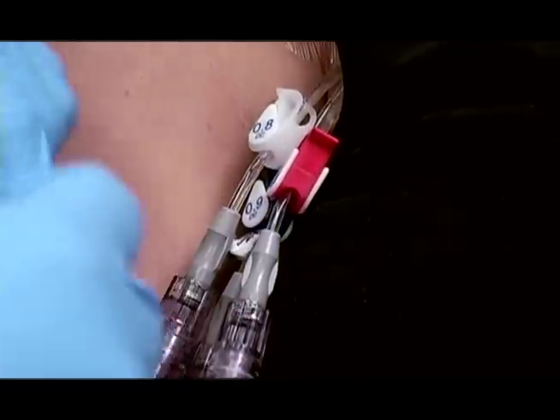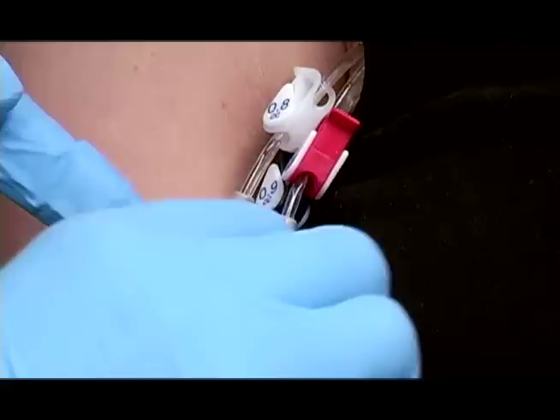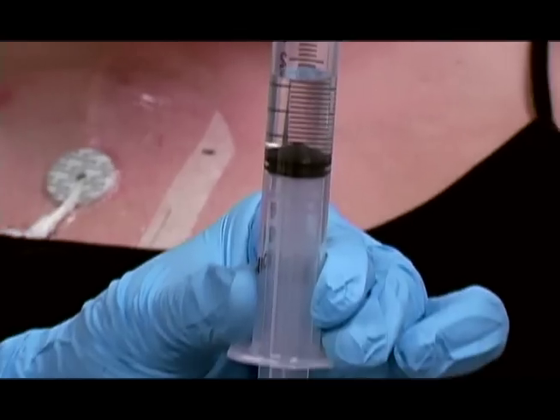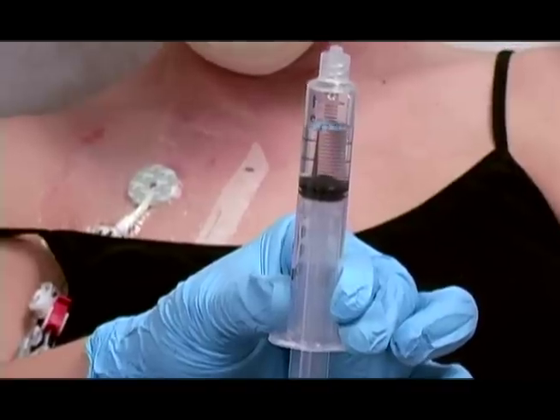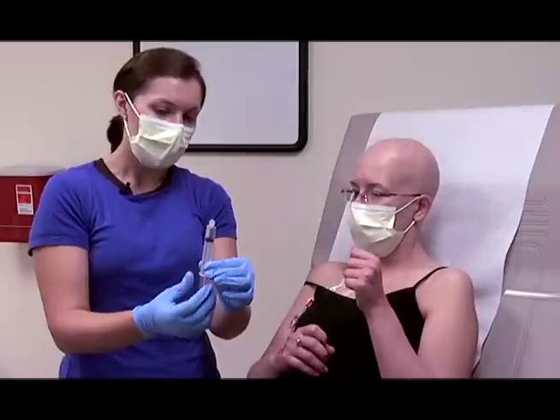In order to keep your lines clean and clear, they should be flushed daily or as instructed by your healthcare team. Your healthcare provider will tell you what fluid you will flush with. This fluid is commonly saline or heparin, which is a drug that helps prevent blood from clotting inside your lines.